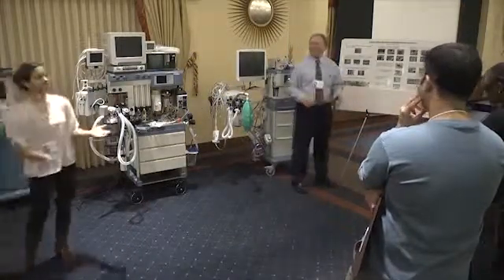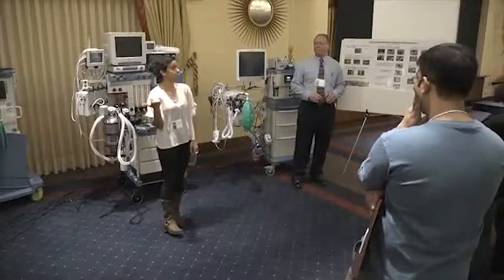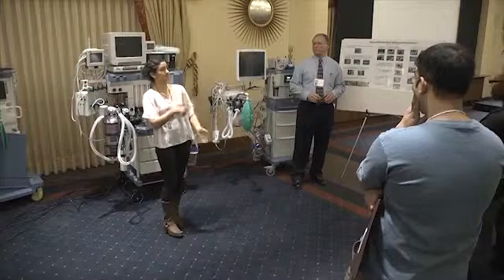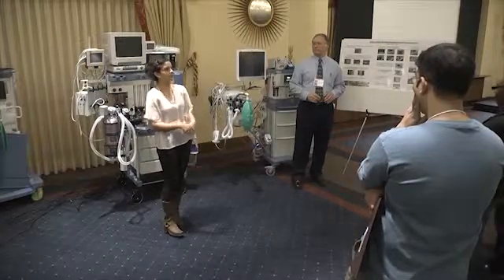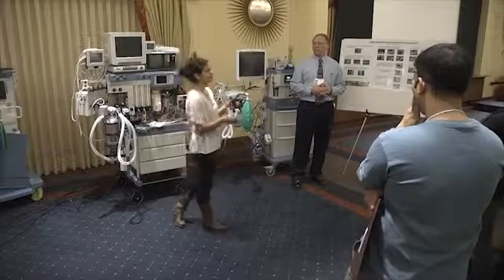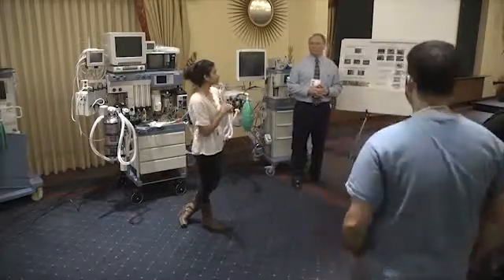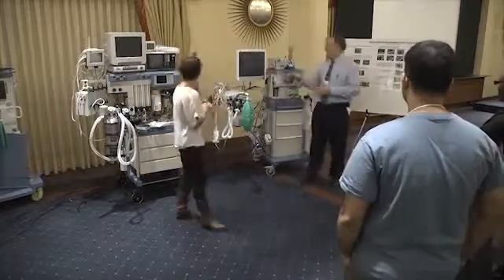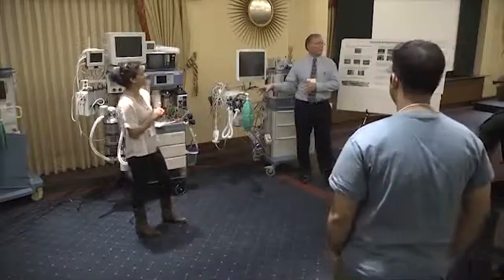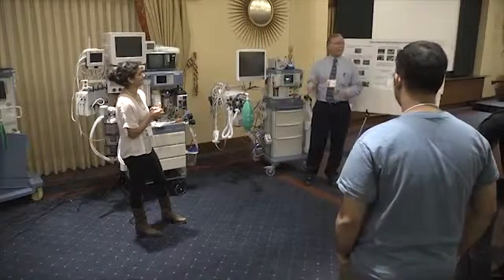It gets tricky though. I mean, we have a lot of things to do, and how many times have you used your ambu bag in an emergent situation? You use them for transporting a patient to the ICU or down, but how many times have you needed to grab it and use it? And so because of that, you end up skimping on things, but then we really need it. And it might be sitting in that bag for years. Think about that. It's just festering in there, it's drying up, and it's not working, and nobody's touching it.